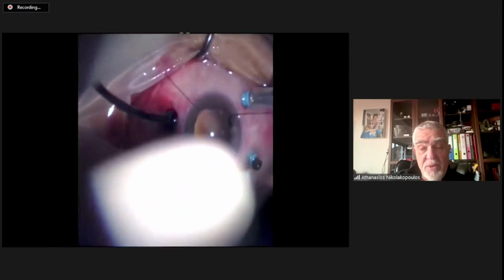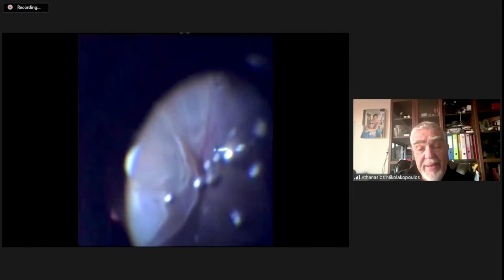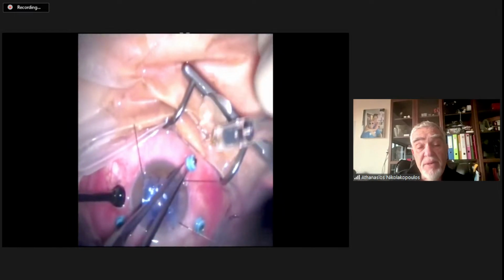And that was the reason that she had been refused surgery. There was too much peripheral PVR, which is the most difficult, that needed scleral pressure, and then I tried to drain to locate the tear. And you can see with the scleral pressure, that's another take-home message. You can detect the tear, and then we tried to use some PFCL.